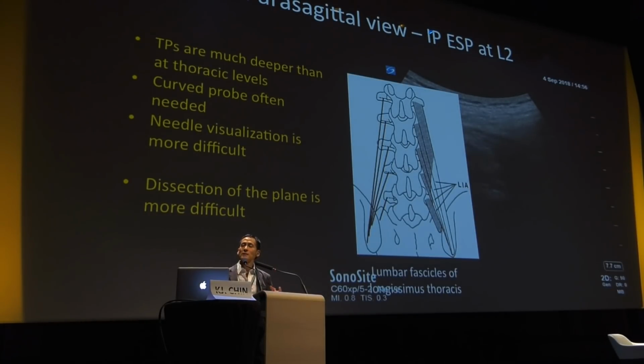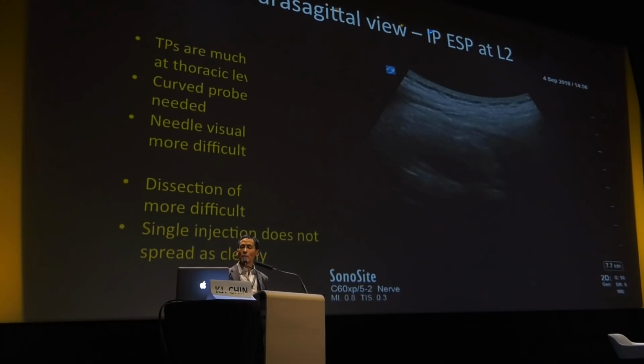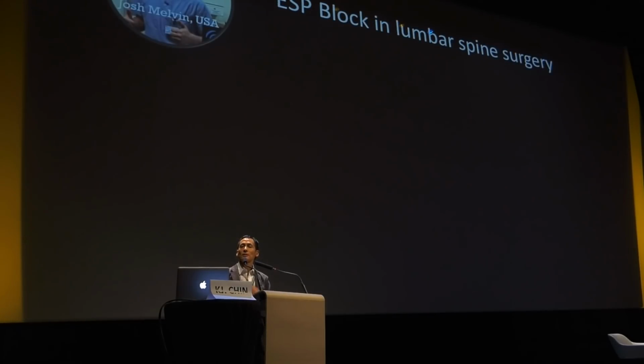So a lot of the muscles are attached firmly to the transverse processes of the lumbar area. And so lifting them off the transverse processes becomes more difficult. One of the ways around this is to inject at a higher level, much as Bansui showed you by putting in a T5 and driving his catheter upwards into the cervical region. You can actually put your ESP at T10 and drive it down towards the lumbar area.